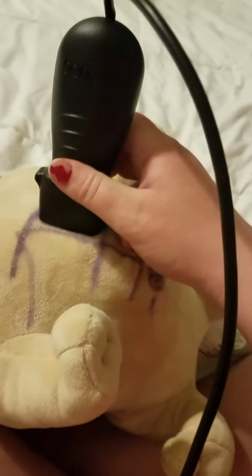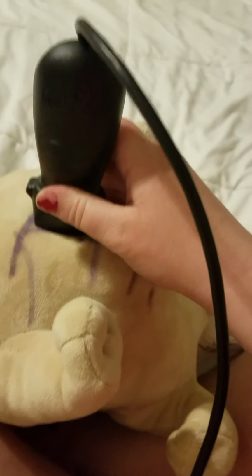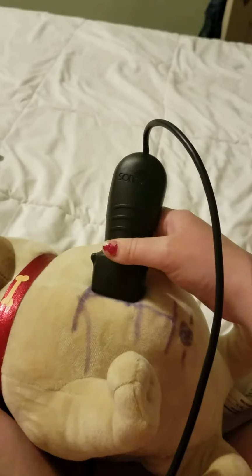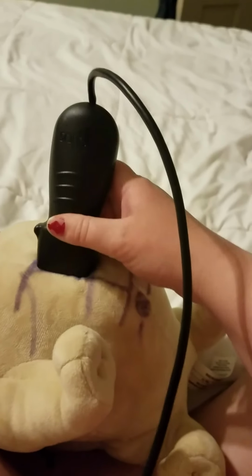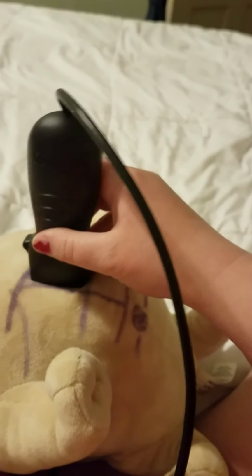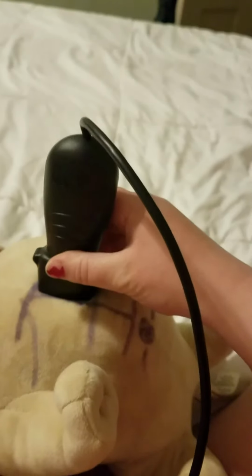So we're going to start up here at the proximal aorta, just left of the midline. The aorta is going to run slightly to the patient's left. The IVC, if you pan towards the patient's right, is going to be seen in long as well. So you can see that there too. You're going to be just below the diaphragm and next to the celiac. So you're going to be in between there somewhere.